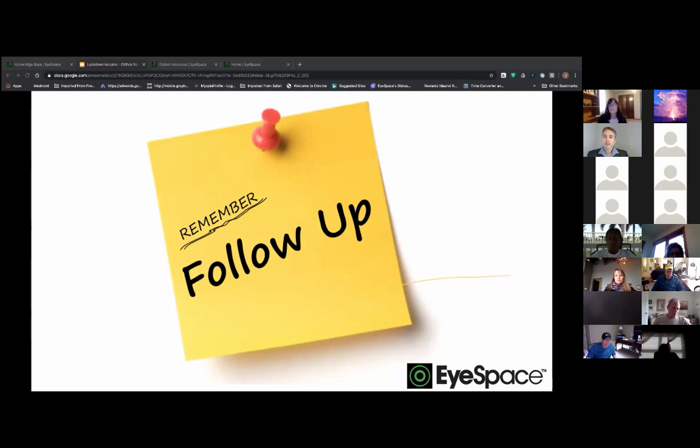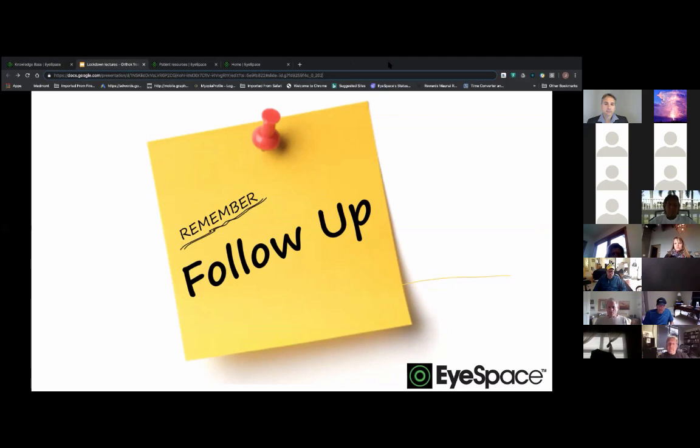Right, next topic. Jagrut, just a quick follow-up on that. We've talked about first day, day 1, when will be your next follow-up? From there, it's 1 week, 2 weeks, 1 month. It depends on the fit and how things are going there. But yeah, generally I follow that.